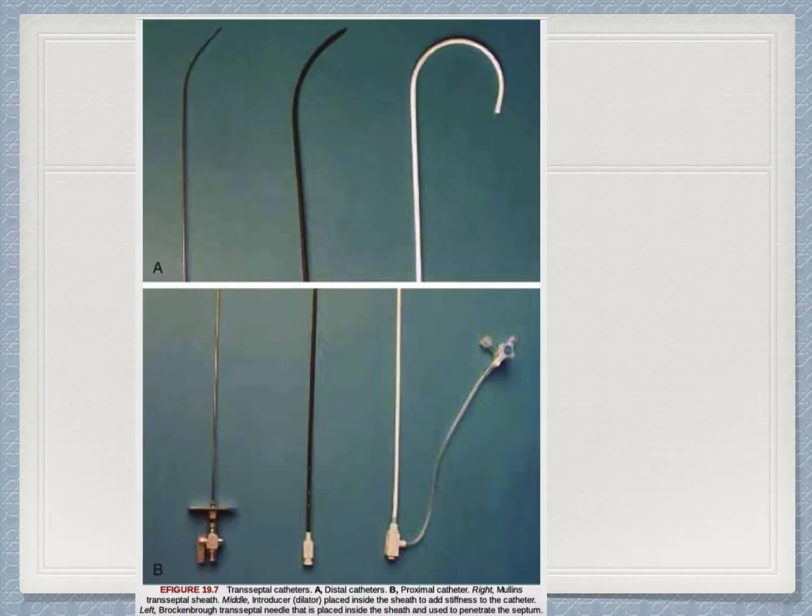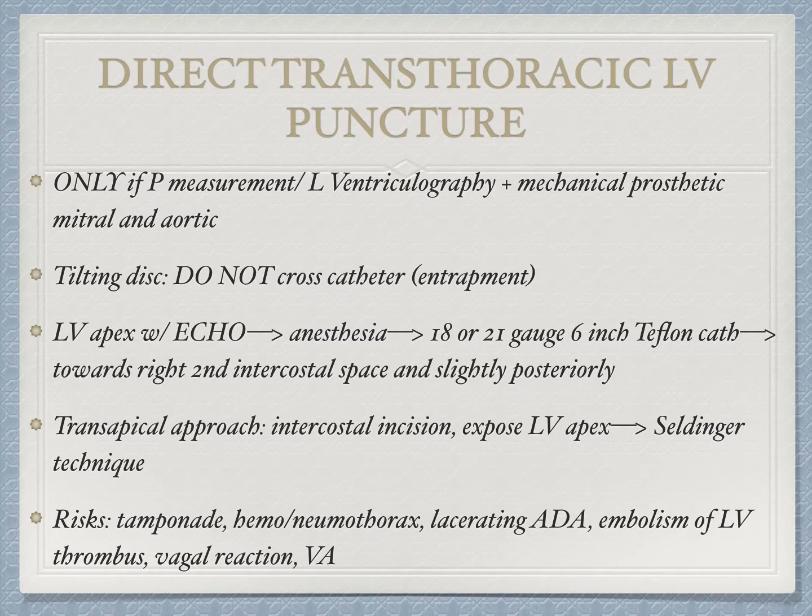Here you can see on the left the stylet, which is what will puncture the interatrial septum, and you have the other catheters involved in this procedure. Now, what about direct transthoracic left ventricular puncture? You don't hear much about it because you can almost always avoid it.